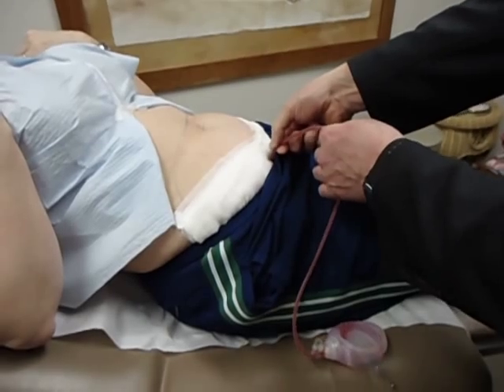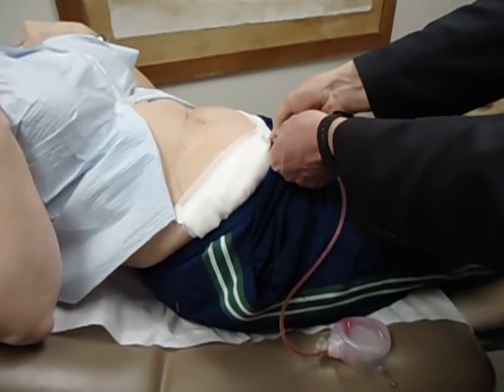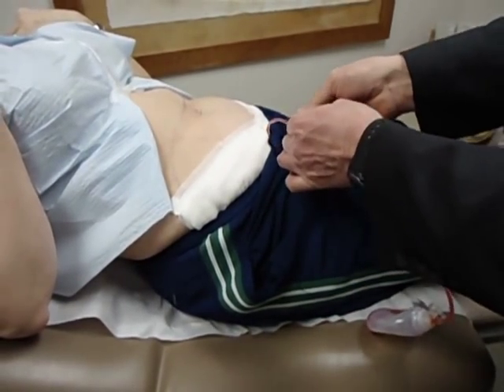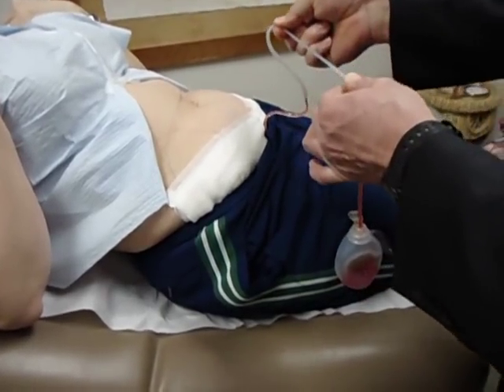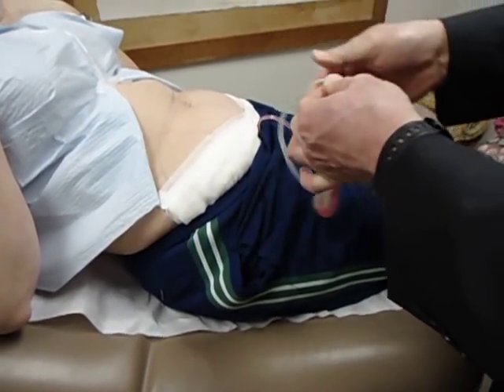I'm going to grasp the tubing near the patient's abdomen with one hand, and with the other hand pull on the tubing and let it slide through my fingers as I milk or strip the fluid towards the bulb.